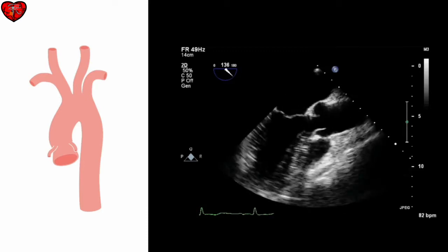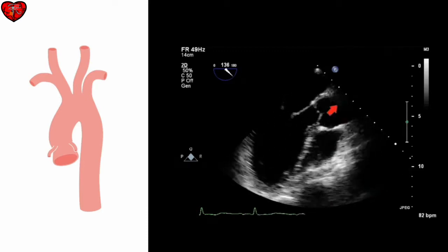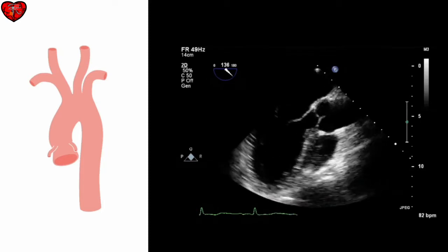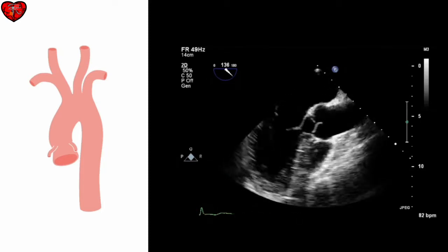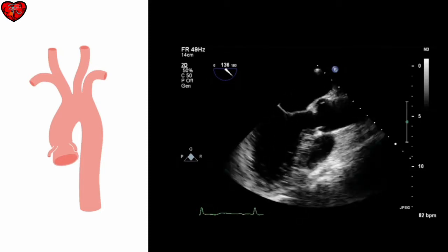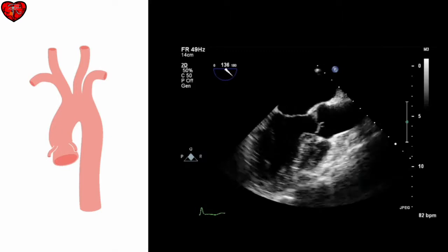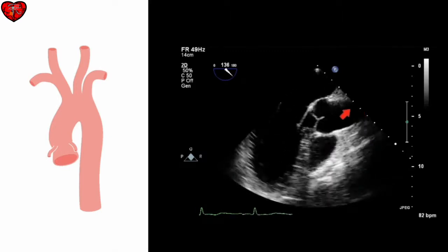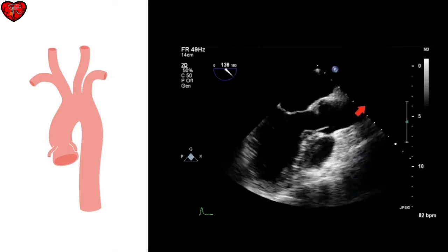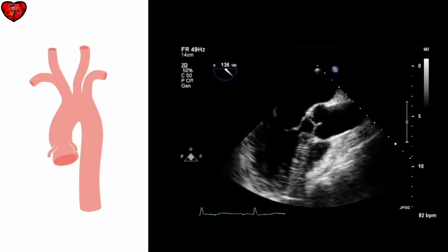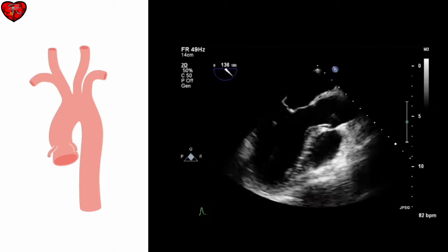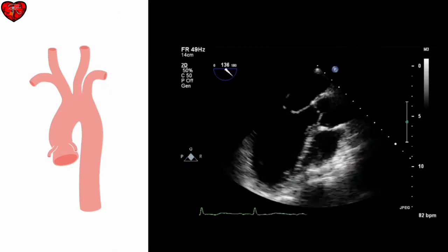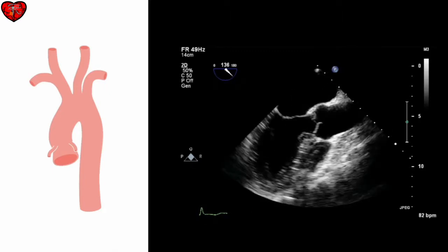As with all of the thoracic aorta, we should look carefully at the anatomy, looking for any areas of dilatation, but also any areas of atheroma and any signs of aortic dissection. We'd be looking for a mobile dissection flap in the lumen of the aorta. The use of colour Doppler can be helpful in assessing flow, particularly when a dissection is suspected.